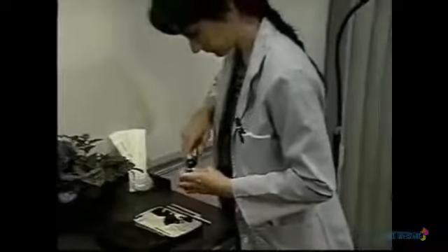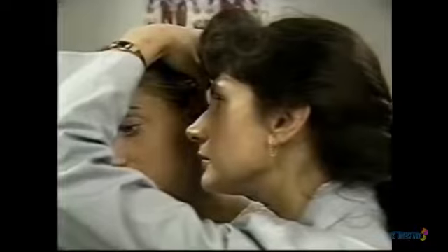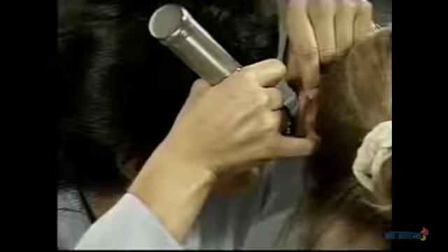Next, examine the ear canal and eardrum using an otoscope. To do this, select the largest speculum the patient's ear canal will accommodate. Position the patient's head so that you can see through the otoscope comfortably. Grasp the auricle firmly but gently, and in an adult, pull it up, back, and slightly out to straighten the ear canal. Then insert the speculum gently into the ear canal. Note any cerumen or earwax that may impair your view. Also observe for any discharge, foreign bodies, redness, swelling, or scaling. There should be none.